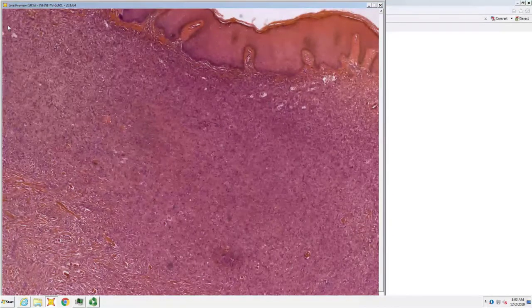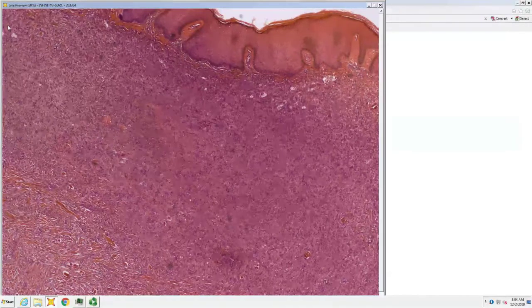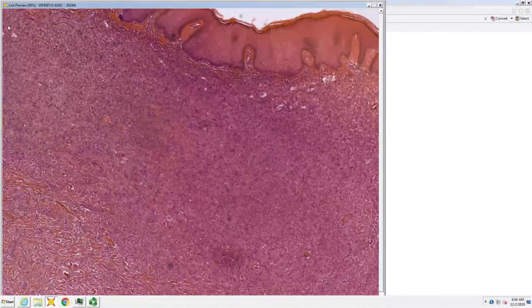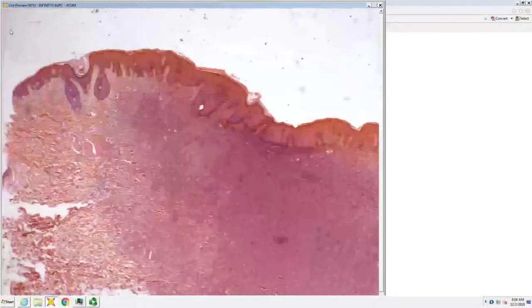One we haven't seen right now is dermatomyofibroma. So describe a dermatomyofibroma to me. Corkscrew nuclei. Corkscrew nuclei, what direction do they go? East, west. Do they move follicles? No. DMF doesn't move follicles, which means it respects all your adnexal structures. So you have your follicles and your eccrine coil just sitting there in that east-west oriented corkscrew nuclei proliferation.